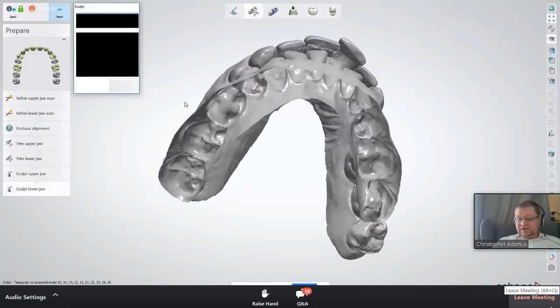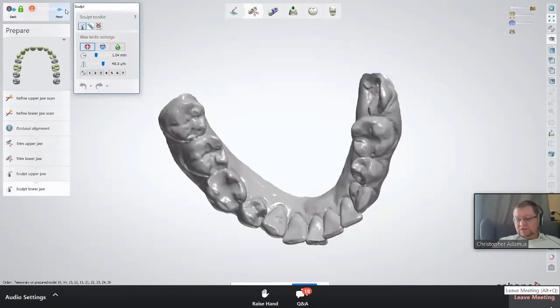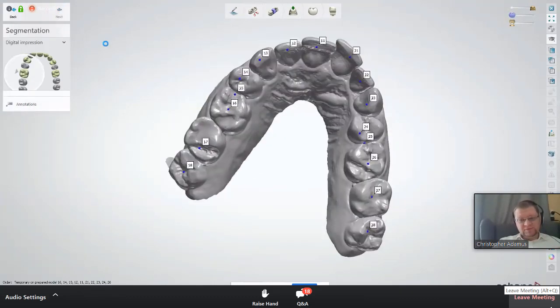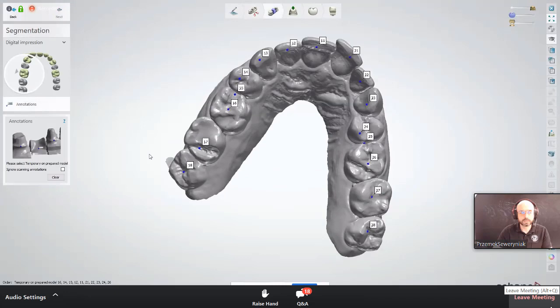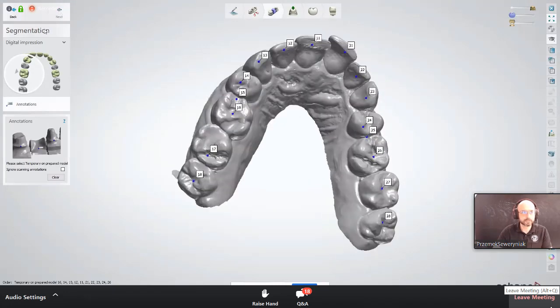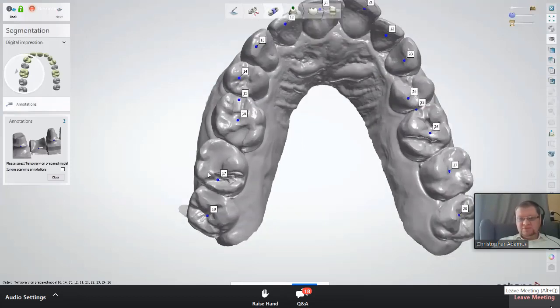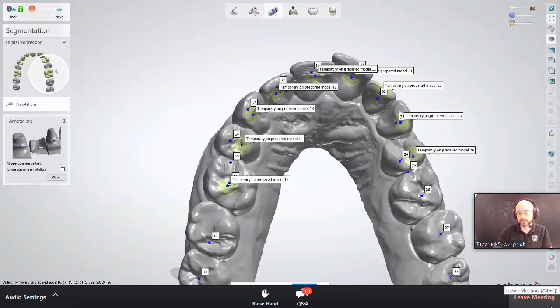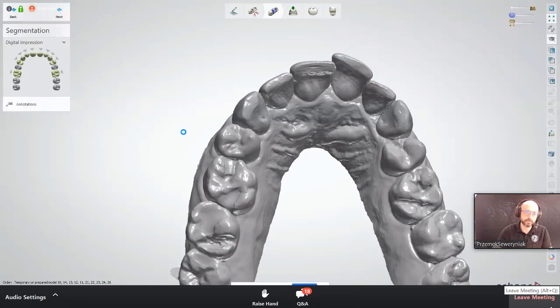Okay, if the doctor will send the case photos with DME and intraoral scans, will the photos get imported automatically or still need to be imported manually? That question you have to rephrase, actually. So if the case is sent from the Trios and they add the photos directly to the case, will the dental system import them automatically? Oh yeah, it will. If they send it with the case on Communicate, it will. Especially if they upload it on Communicate before you accept the case, and unless you change the name on the case, then the photos will be there.